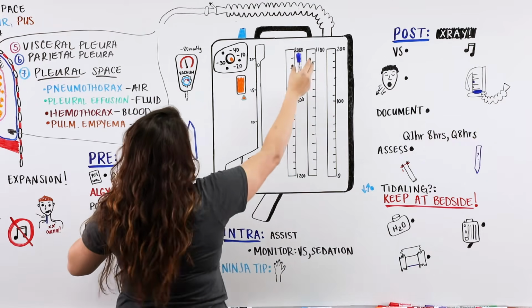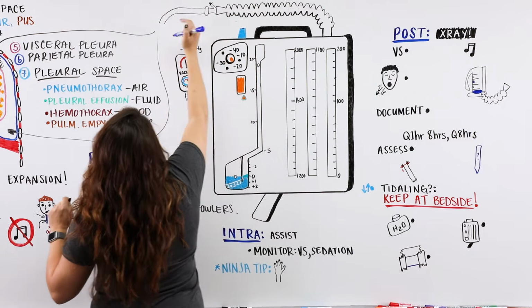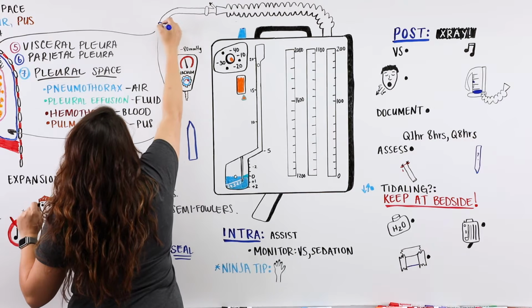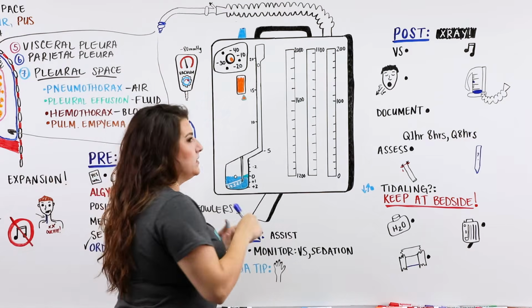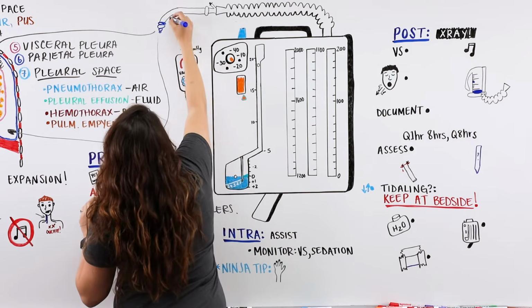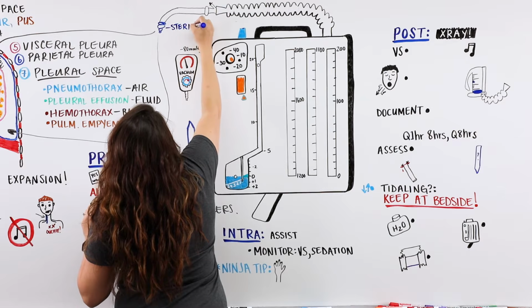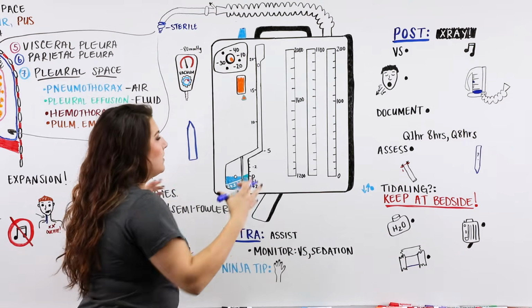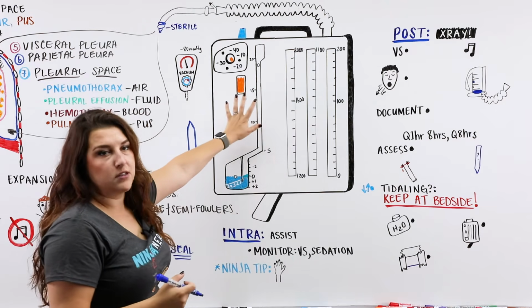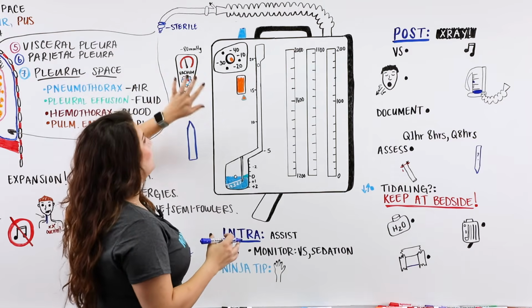First, let's just look right here. This is the tube that's going to be connected to our patient. And the most important part about it is the ending, which I'll just draw what it kind of looks like here. Typically, it's like this little point that's going to be attaching to our chest tube that's within the patient. So the most important thing is to remember that this portion needs to be sterile. When you open up the chest tube, this is packaged on the back, and when you take everything out, this doesn't need to be sterile. Nothing else in here really needs to be sterile at all, except for that portion that's going to connect to the patient.